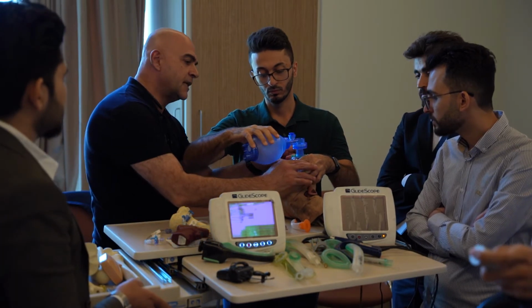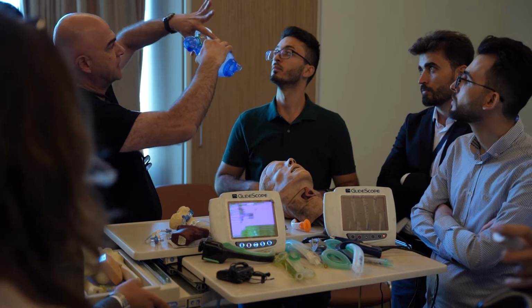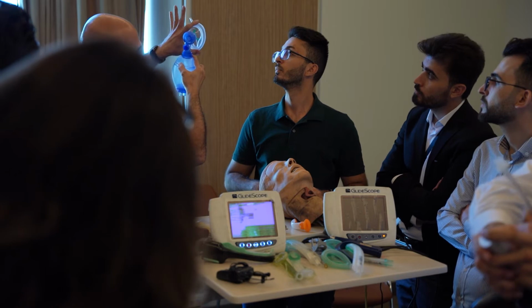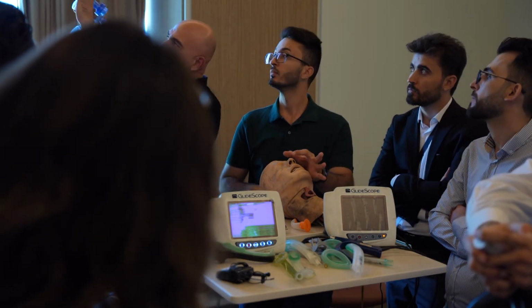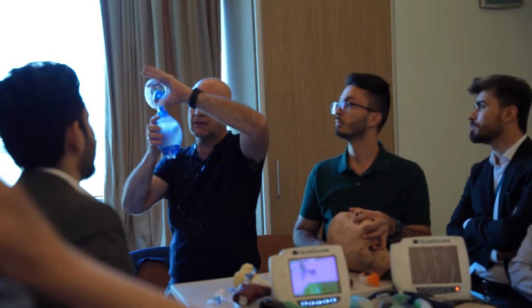Okay, just try to make a C on half of the mask, on one side of the mask. It is not a C like that, okay? C half of the other side of the mask, whether you are left hand or right hand, like that. The C will be on the sides of the mask, not on the center, okay?